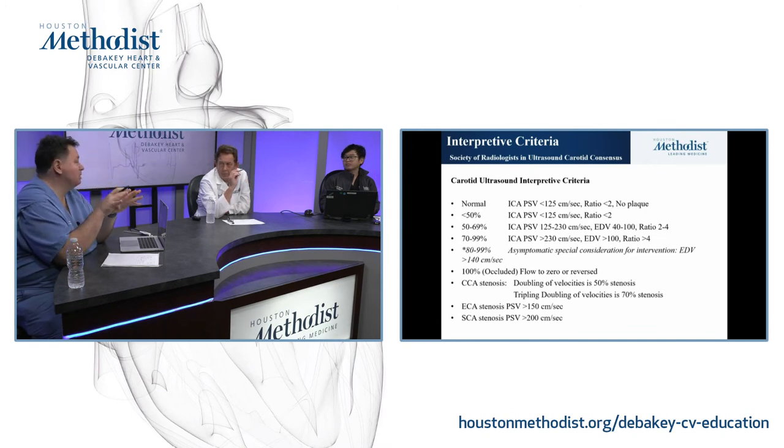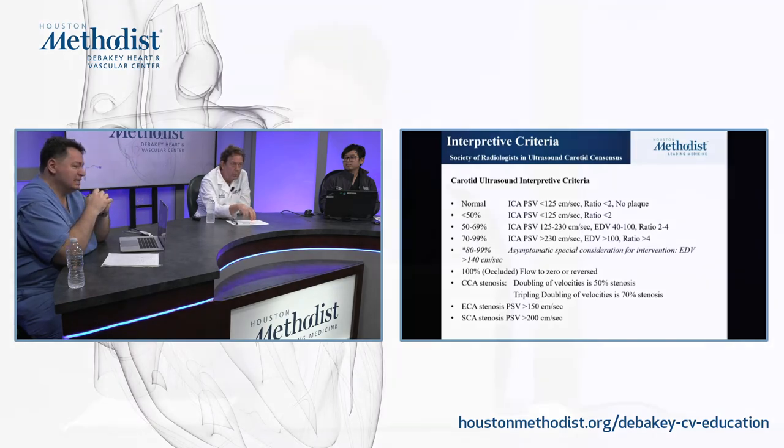And this is from 2003. That was a consensus where multiple specialties got together. I think it's really painful that IAC, the credentialing body, did a review of how many different protocols we're using in the United States. As of today, we probably have about 30 to 35 different protocols. And for the criteria, you need local validation compared to angiography, and then you can use your criteria.